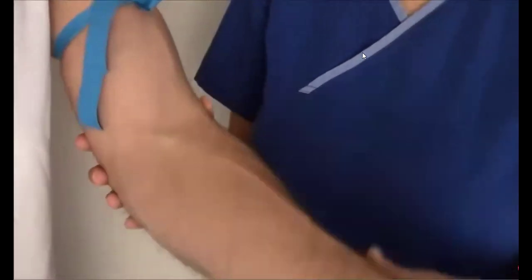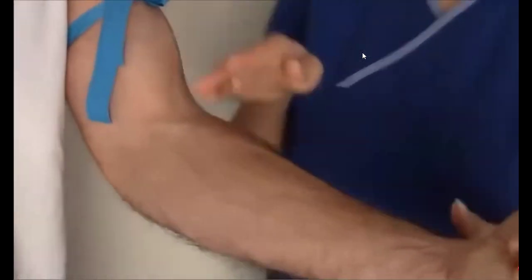Next region that people like to stick IVs in is the forearm. Typically the forearm is from here to here. So that's the forearm area. There's a lot of veins in the forearm. On this person, he has a really, really nice vein right here. It's very large, a little bit of a skinnier one right here, and then some more in this area. Typically people like to go in this area, but I have seen them on the top of the arm. Not a lot of people have superficial veins in the top of the arm, and then on the back of the arm too. There's some.